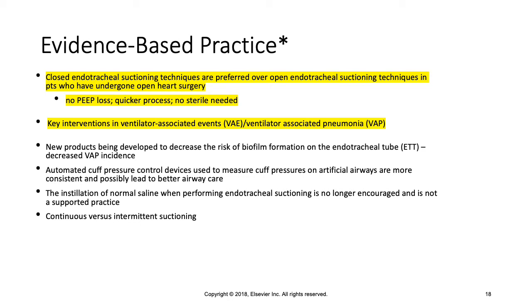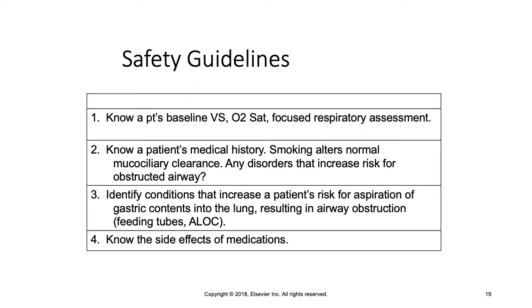I'll show you how to do both. And when you get to your clinical sites, if you are able to perform this skill, you want to look at their policy and see if they are using intermittent suction or continuous suctioning. Some places have gone to continuous.